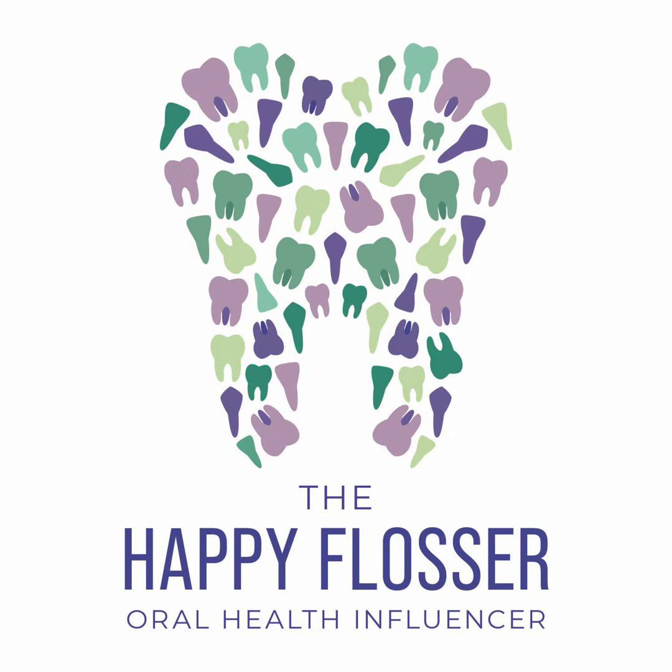Bony defects, as I said, are really difficult to see on a radiograph, but sometimes, especially those maxillary first premolars on the mesial or the mandibular first molars on the mesial, sometimes those mesial root concavities are very significant for some of our patients, and those will show up on your radiographs, which is really, really helpful.